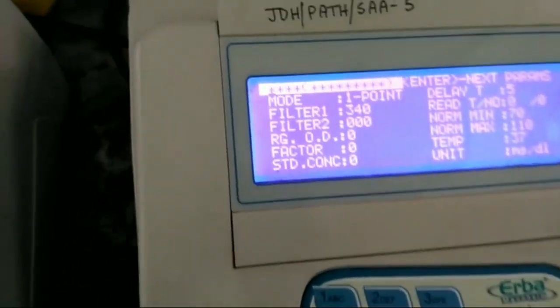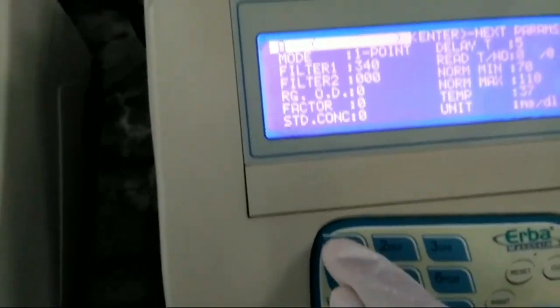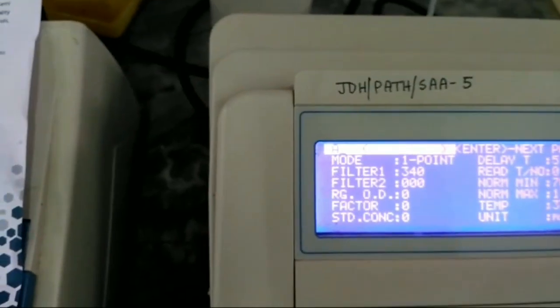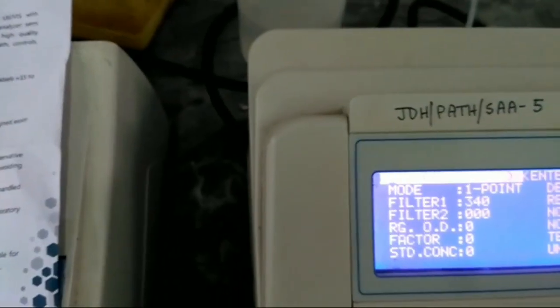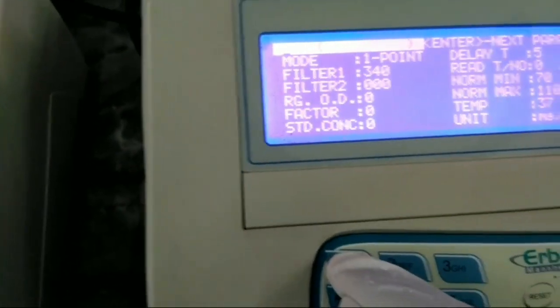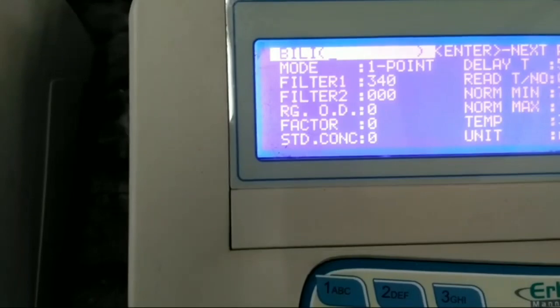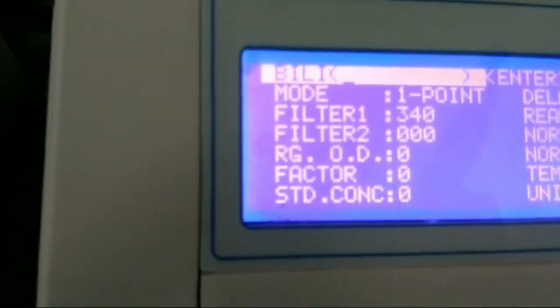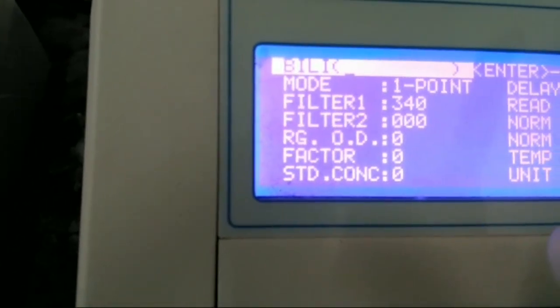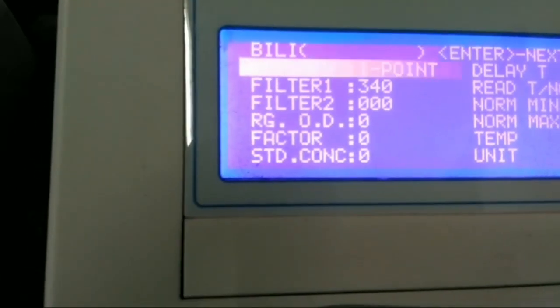First you have to write the name of the program. It is 'Total Bilirubin', so we are writing 'bili' for this program. You can use the switch to write it. Total bilirubin is an endpoint test procedure, and endpoint is represented in this machine as one point.